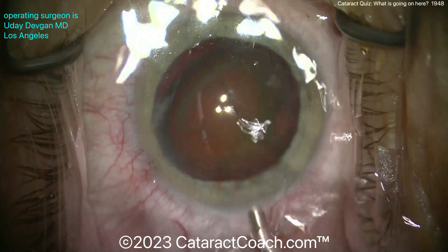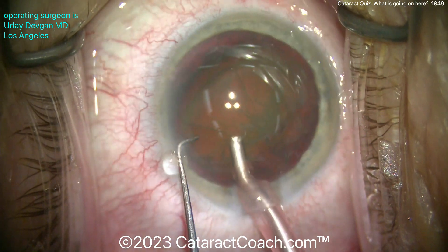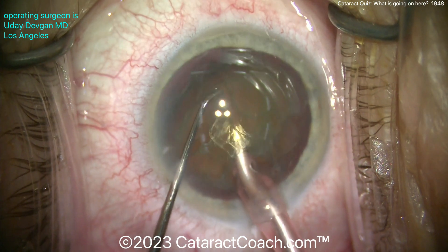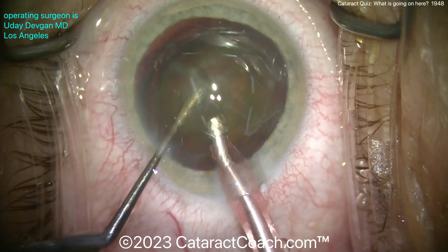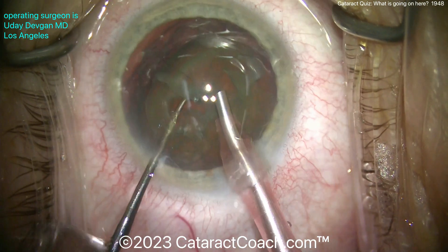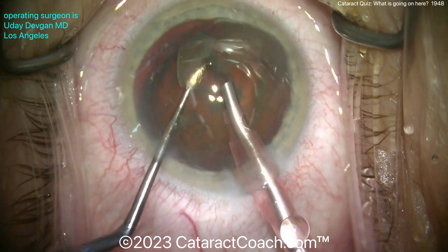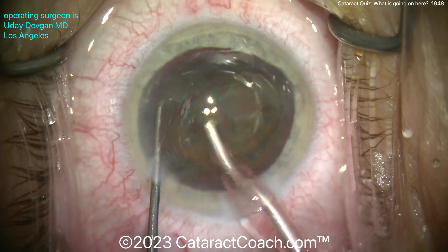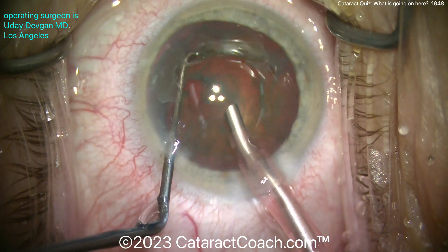Now I want to show you these real cases from my own clinic, my own operating room, to show you the thought process that goes through my head. So buzz in that nucleus — I'll chop it in half. Not really concerned about too much here. Kind of a chop — not the best — try again. Maybe I can just do a Lindstrom-style tilt and tumble instead. Nope — there's the nucleus, so you can break it up in little pieces.